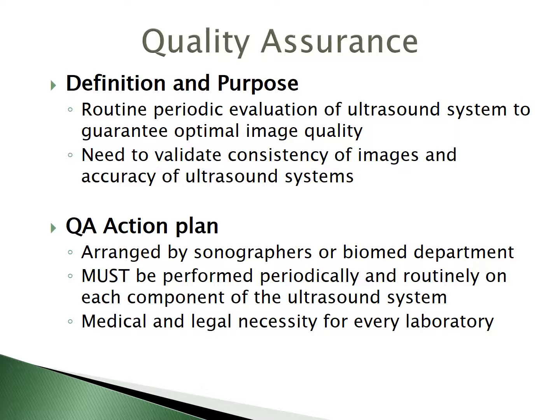When we consider quality assurance, we need to make a quality assurance action plan. Typically, this is going to be arranged either by sonographers or, if you work in a larger hospital, through your biomed department. They are the ones that typically take care of machines, the IV poles, the CT, all of that, that is not covered by the manufacturer anymore.